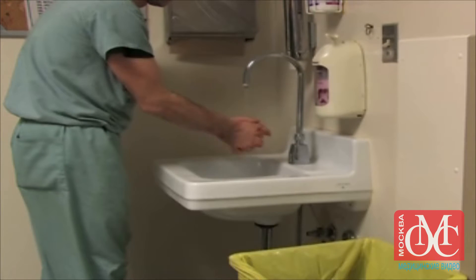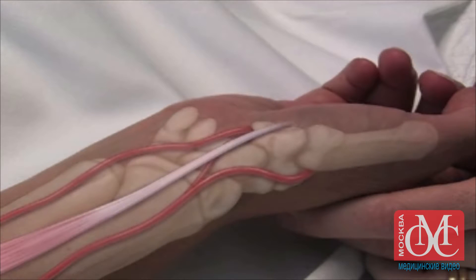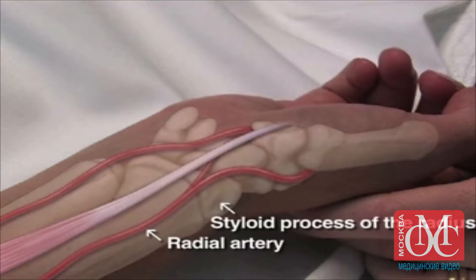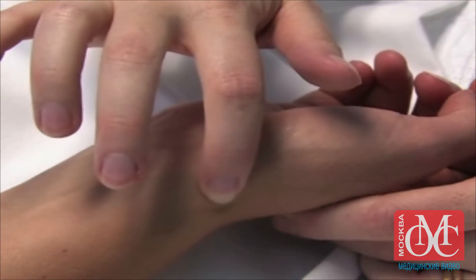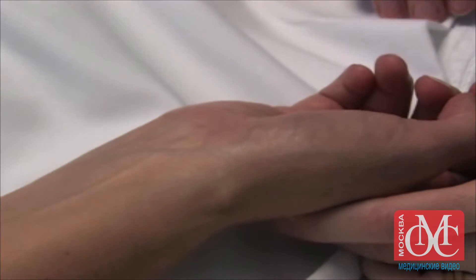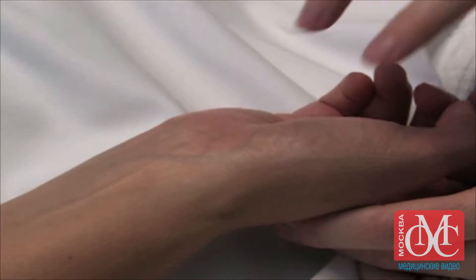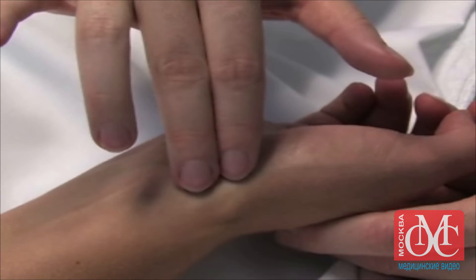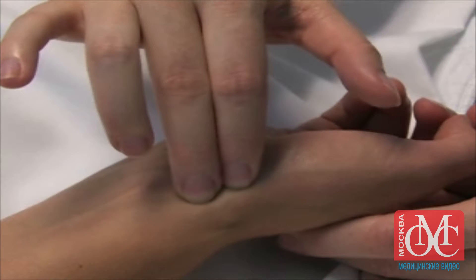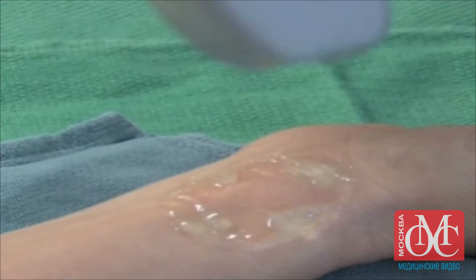Wash your hands according to good standards prior to examining the patient. Extend the patient's wrist to bring the radial artery close to a more superficial position. The radial artery is located between the styloid process of the radius and the flexor carpi radialis tendon. First, palpate the styloid process of the radius. Next, palpate the flexor carpi radialis tendon located medial to the styloid process of the radius. Now locate the artery between these two points. The artery may be difficult to palpate, for example, in the presence of overlying edema or vasospasm. A portable Doppler ultrasound device may be used to identify the location of the radial artery in these instances.